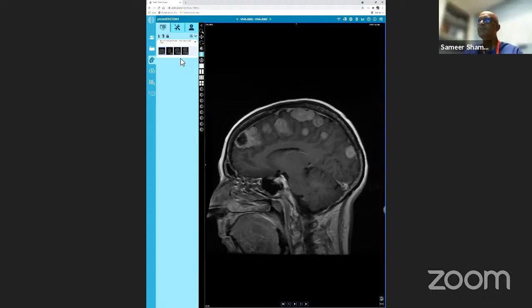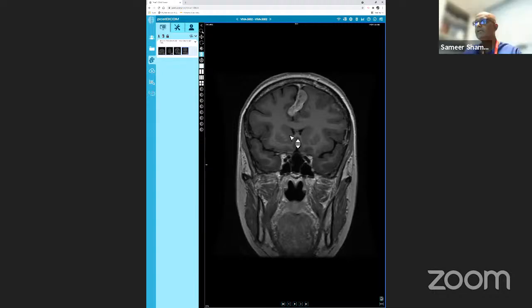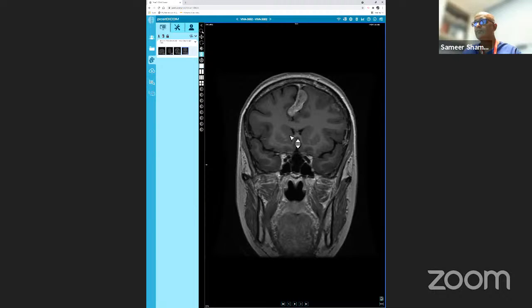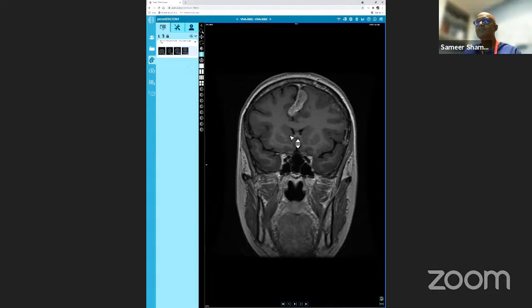What else is neurofibromatosis type 2 associated with? So you get multiple meningiomas and ependymomas and schwannomas. Okay. And anything in particular? Vestibular? Vestibular schwannomas. So do you want to look for it? Yes, okay. So that will confirm your diagnosis, isn't it? So click on the image and scroll.